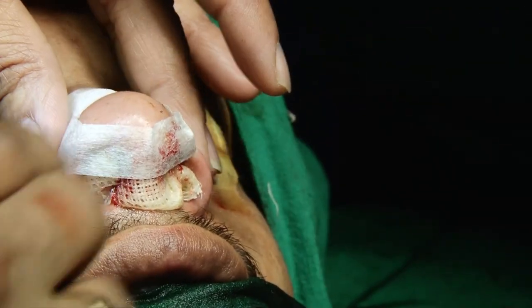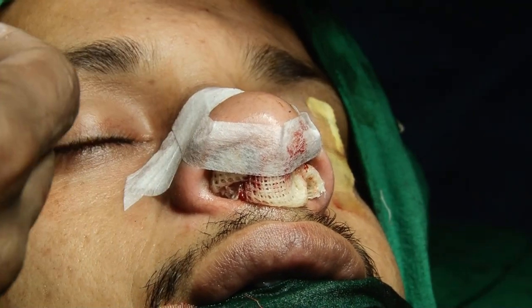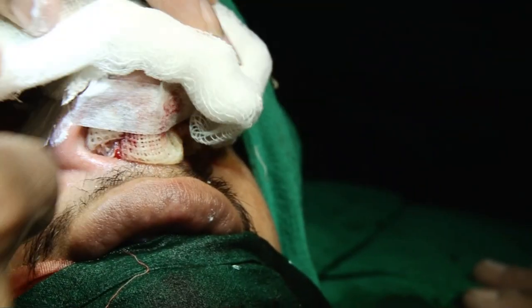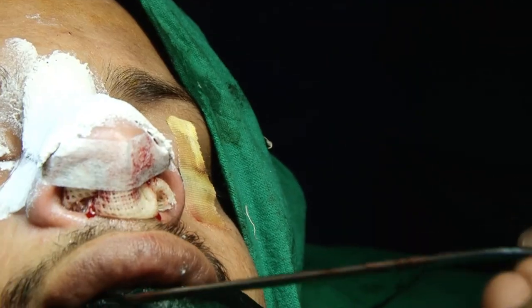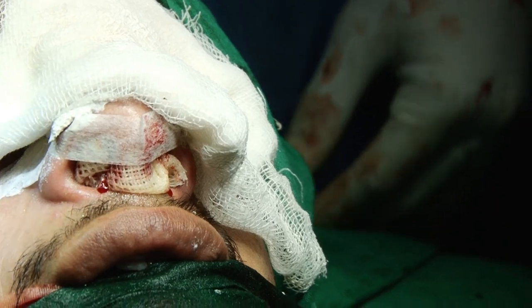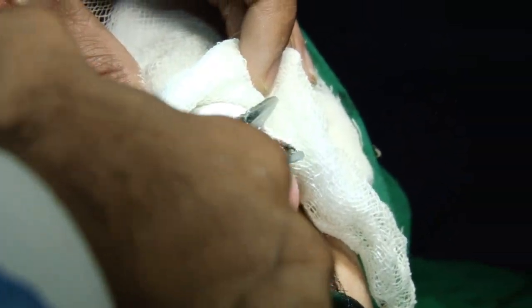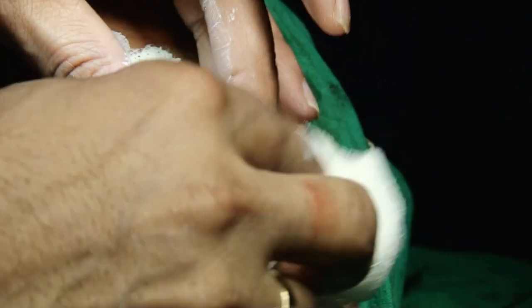Love. POP dena. So the POP: one layer of steri strips and then a second layer of this POP. And again one layer of the steri strips I usually use. Give me the scissors. Still some people use a long POP on just the forehead also. I never use it on the forehead. Steri strip.